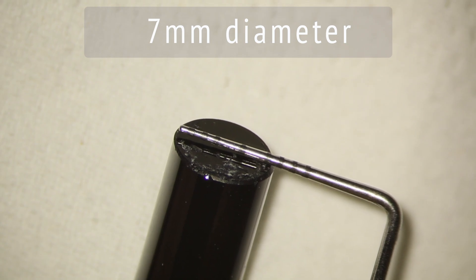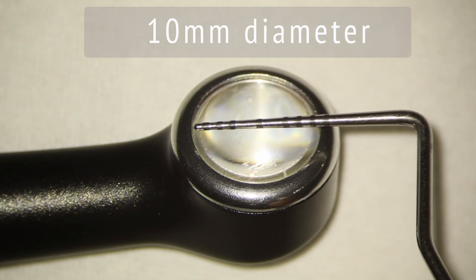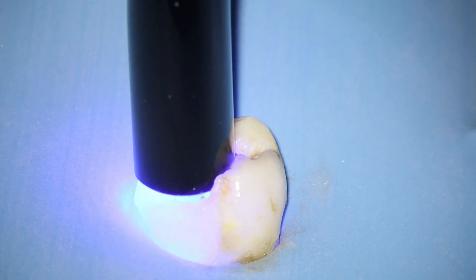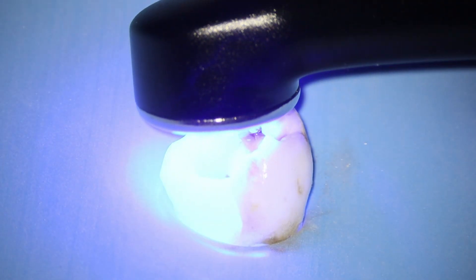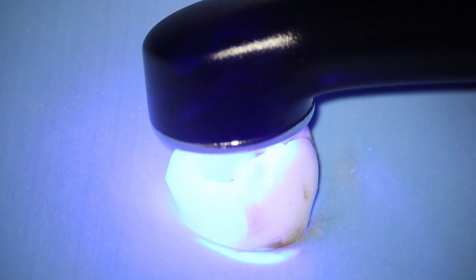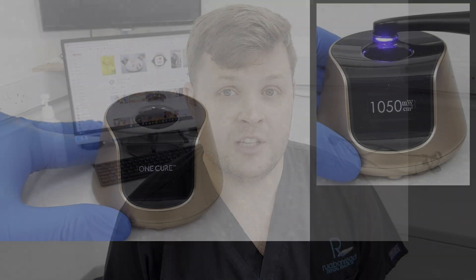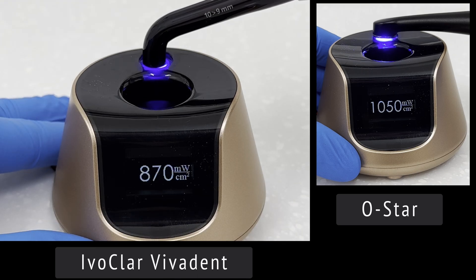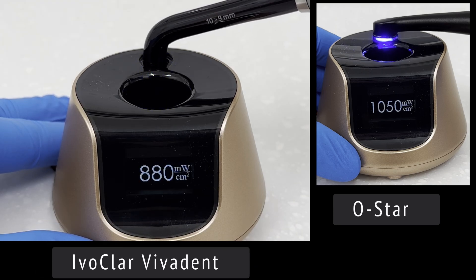The second thing to mention is the optical head size. The BA International head is much smaller than the Ostar's, which matters because if the surface area you need to bond is larger than your light's head, you have to cure twice to ensure full coverage — wasting time. With the Ostar's relatively large optical head it can cure a larger surface area in one pass. Additionally, the Ostar's light intensity outperforms both competitors, with the BA International notably lower and the Ivoclar slightly better but still not matching the Ostar.